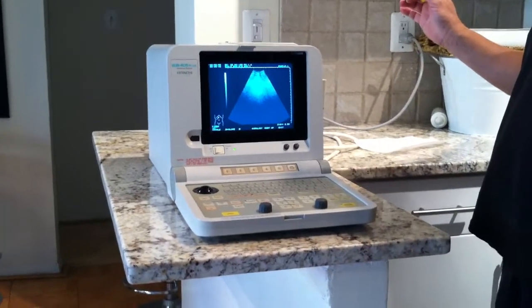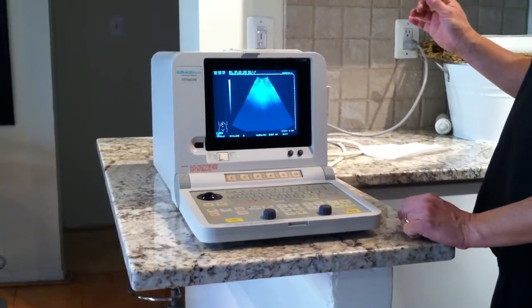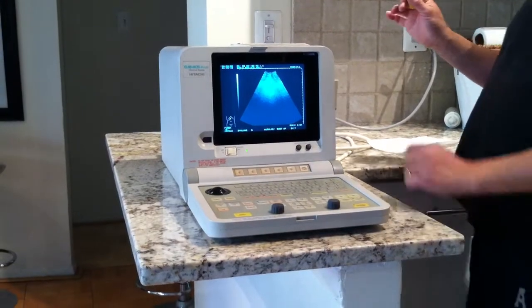Hello, we are testing the probe right now — the 3.5 convex. We want to see if it's got any dropouts.